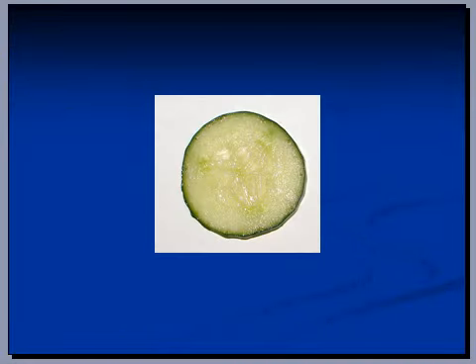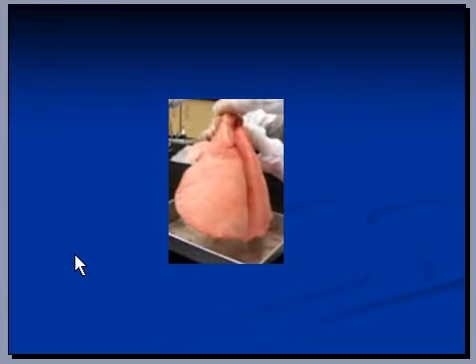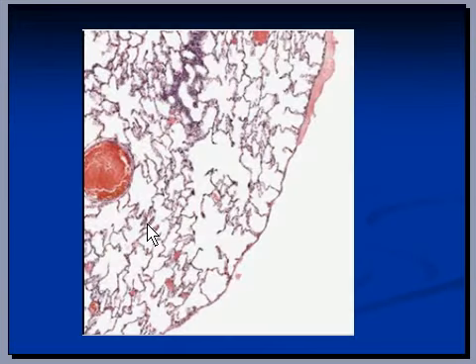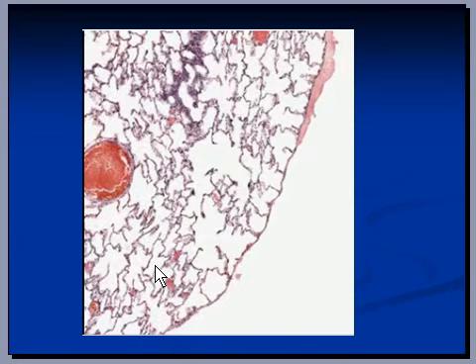This is a cucumber and this is a cross section of cucumber. This is a photograph of lungs and this is a cross section of lung under microscope. These spaces are alveoli and they are filled with air — that's how they should be. This area of lung is absolutely normal.